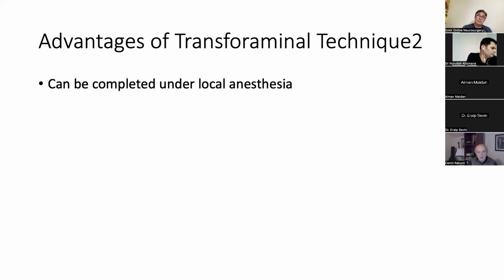People who experience intractable lumbar disc herniation need surgical treatment if non-operative therapy is ineffective. However, it is a known fact that the patients are afraid of general anesthesia with the thought of not waking up again. Because of this fear, patients may refuse spine surgery and their quality of life may decrease. In such cases, transforaminal discectomy using local anesthesia could be a life-saving option.